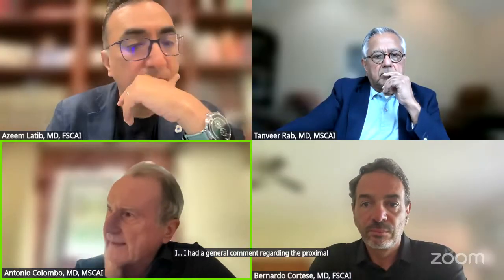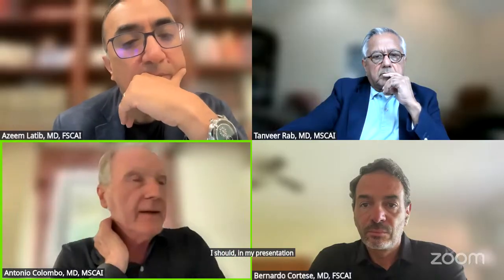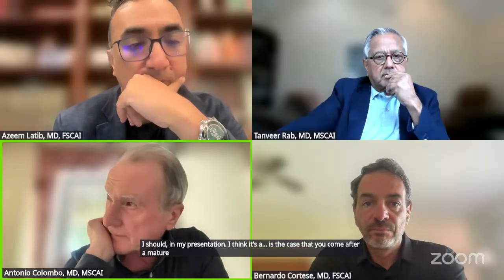I have a general comment regarding the proximal LAD. The final case I showed in my presentation is a case that you come to after a mature period. But my conclusion now is I put a stent if I really need it, not because the tradition tells me that in the proximal LAD you should place a stent.